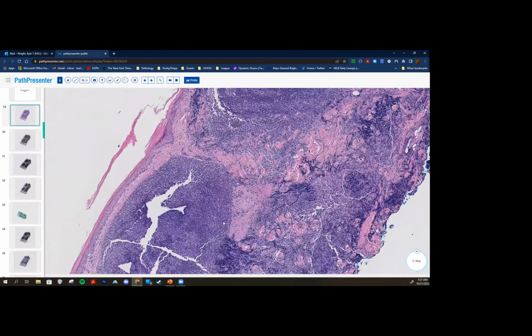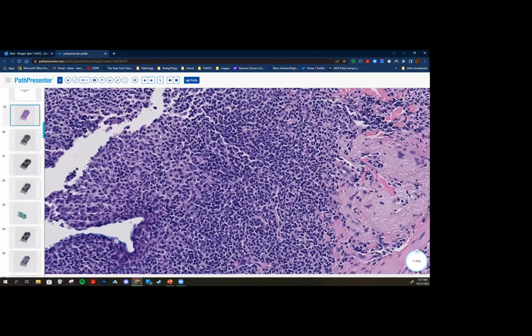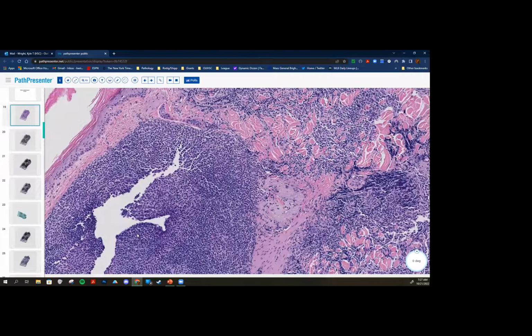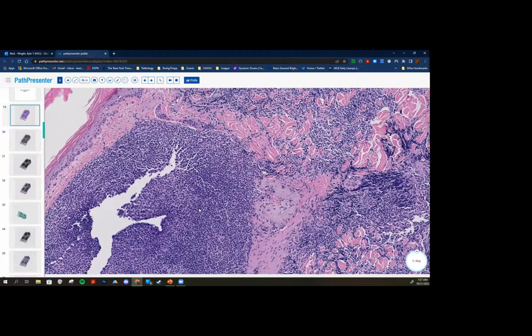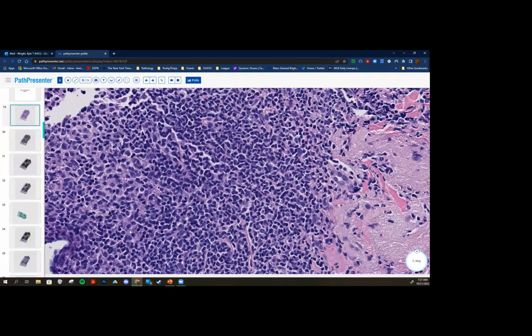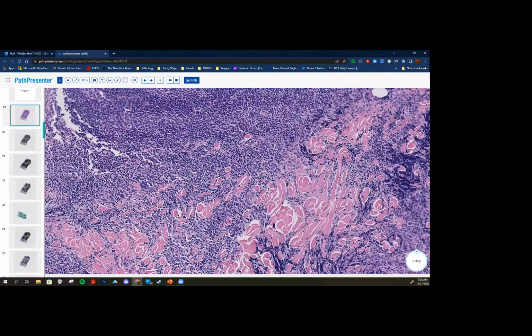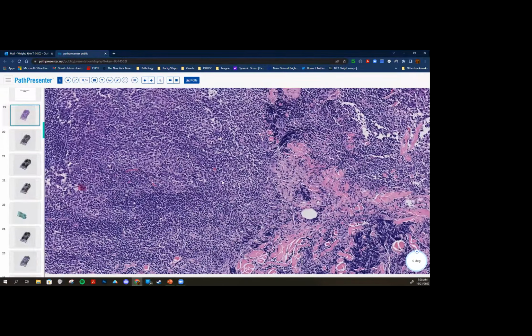So you can see that this infiltrate, unlike the last one, which was a superficial perivascular periadnexal infiltrate, this one actually has set up some level of underlying architecture. It's composed of both smaller-sized lymphocytes and some larger-sized lymphocytes, as well as some background macrophages. Fairly few, if any, granulocytes. There might be some plasma cells in here.